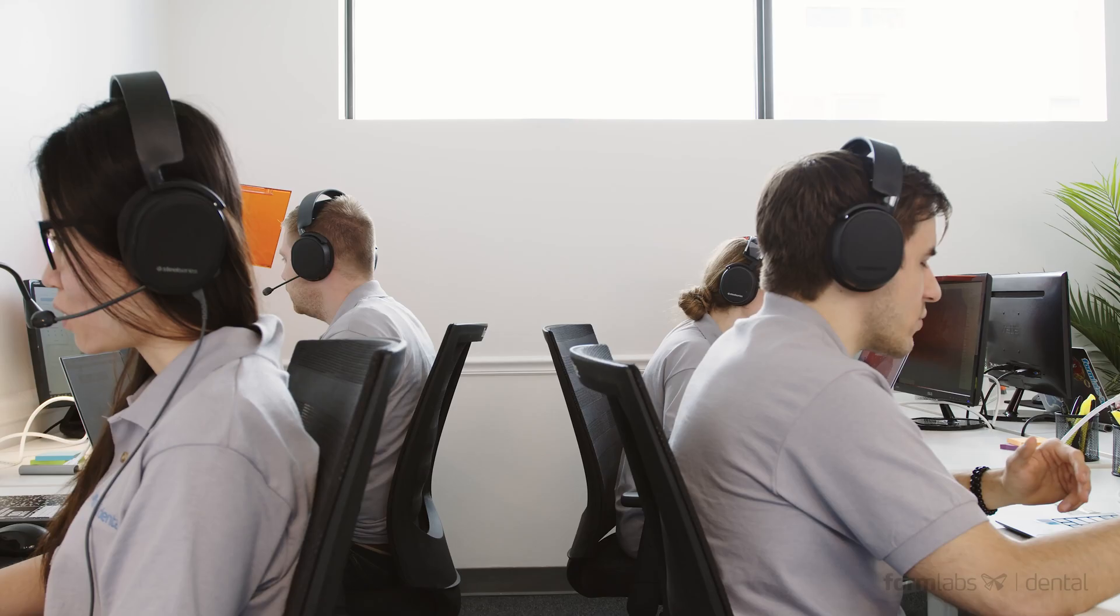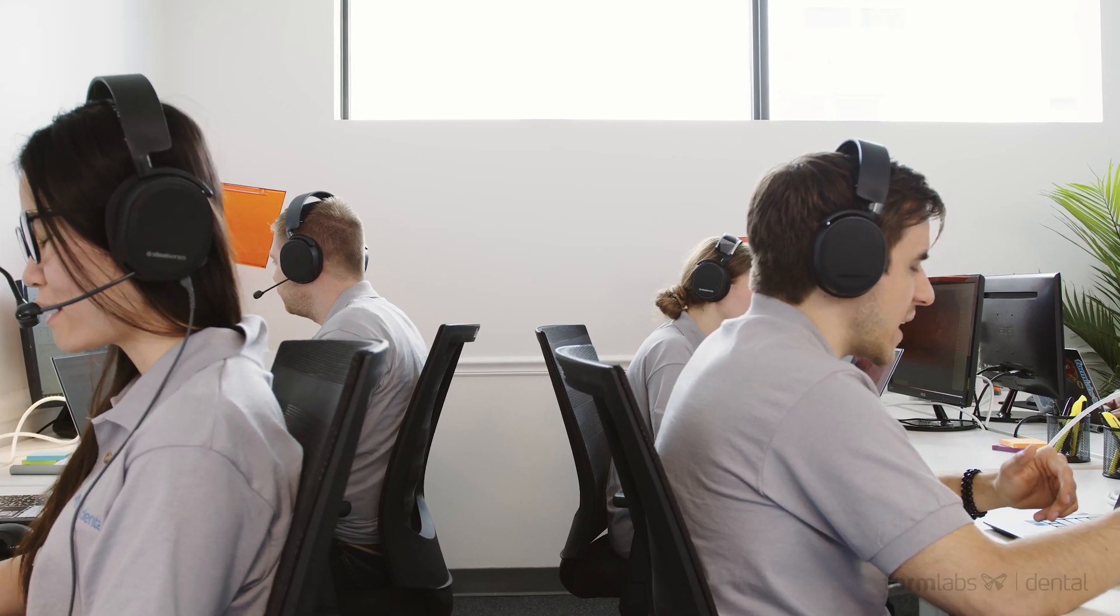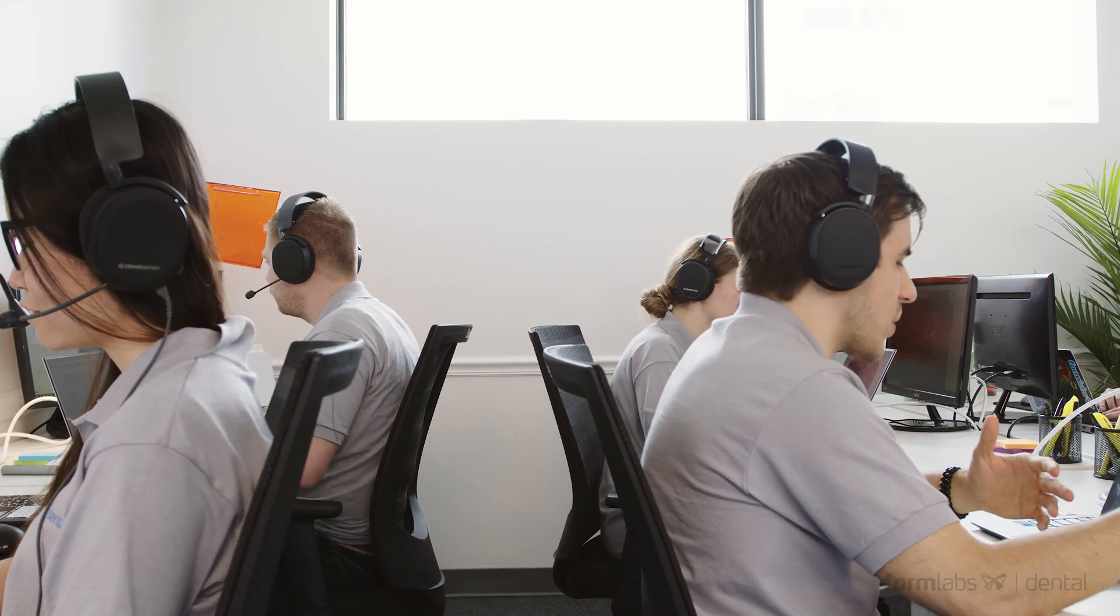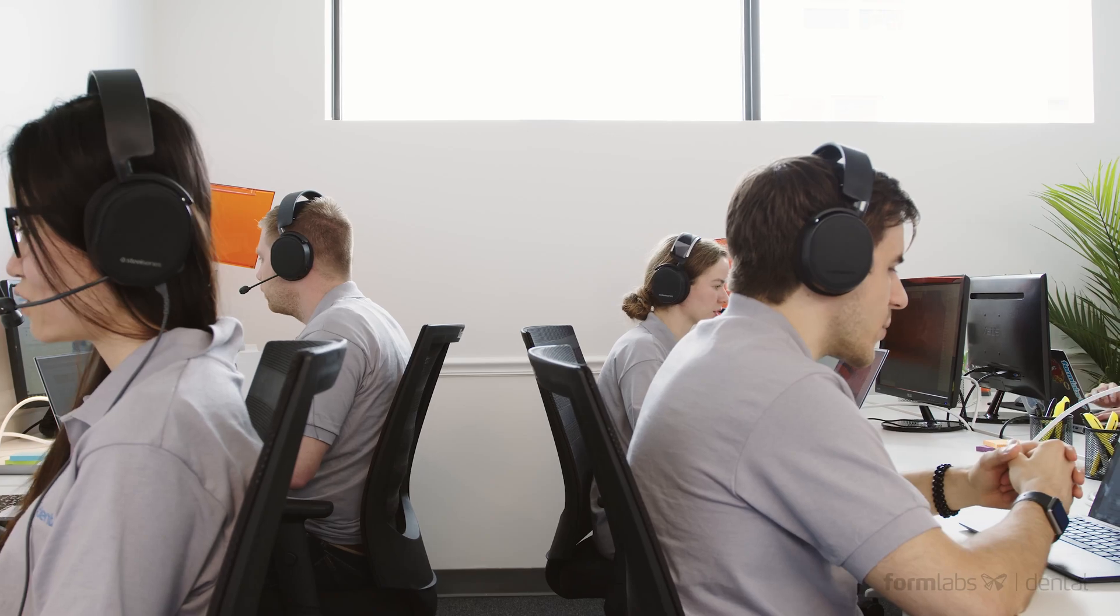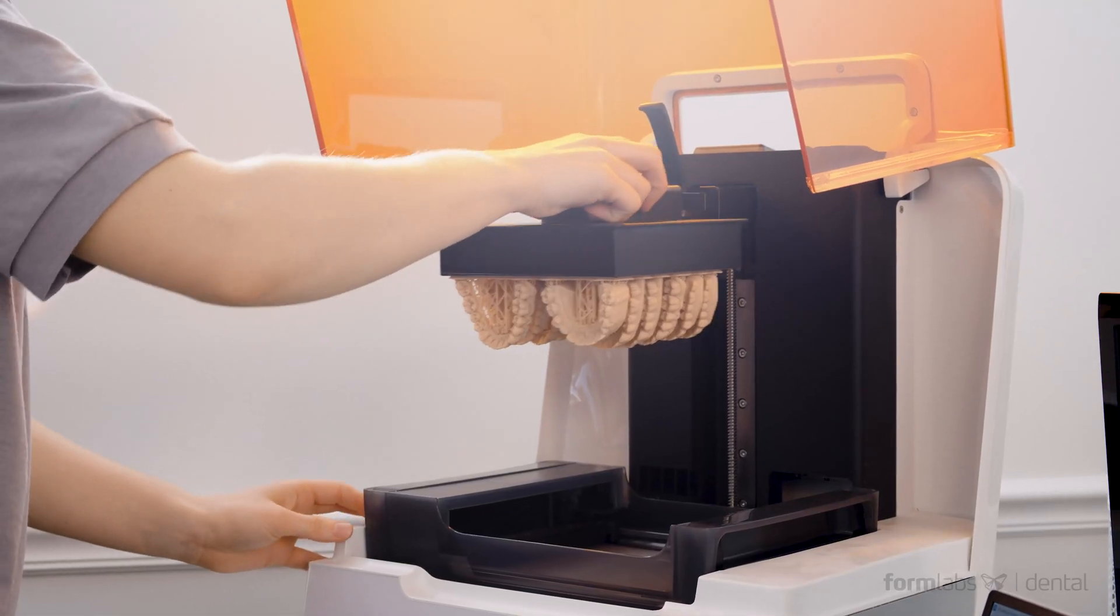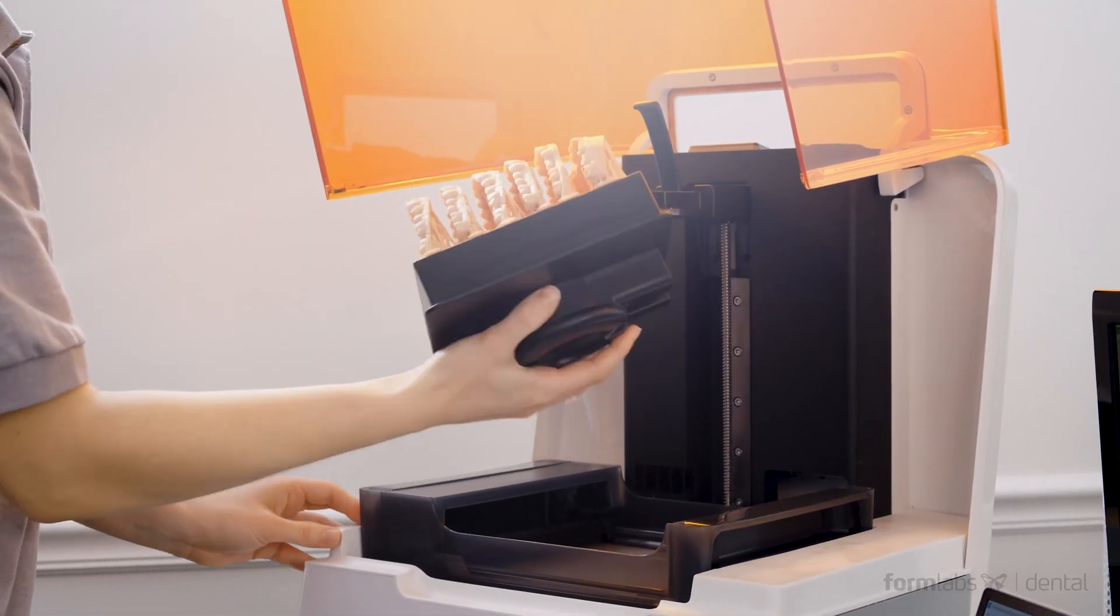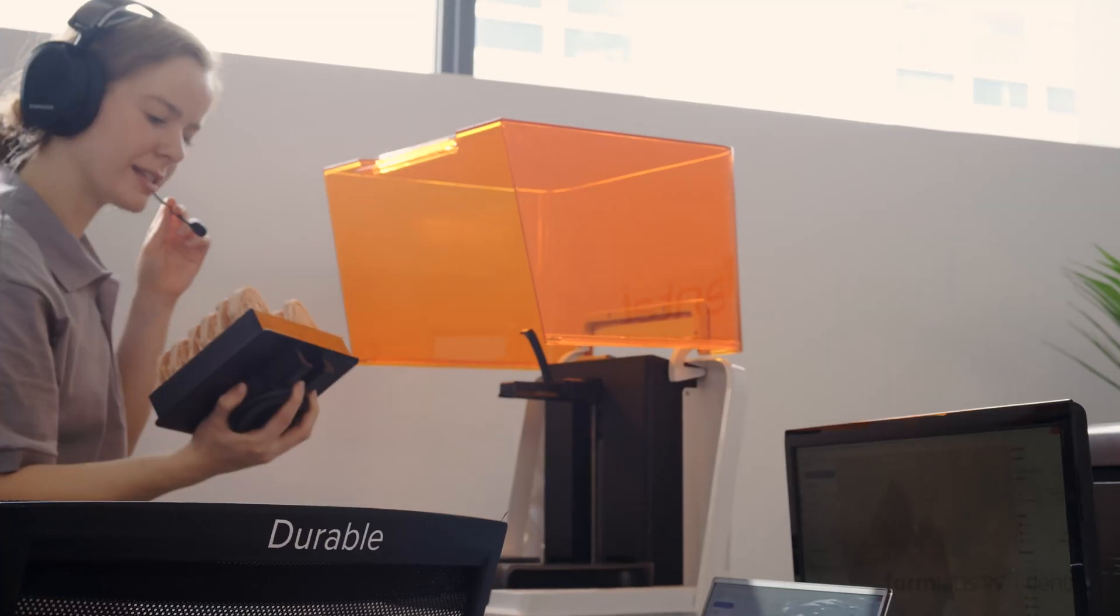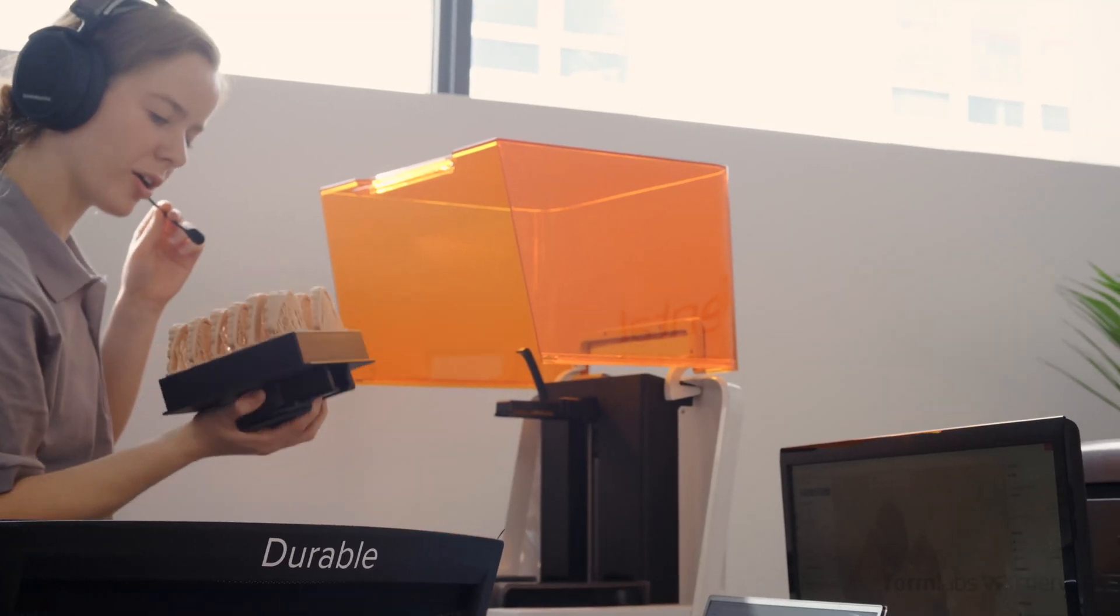And if anything goes wrong, help is just a phone call away. Our new dental service plan includes personalized onboarding training, proactive check-ins, and the best phone support in the industry.